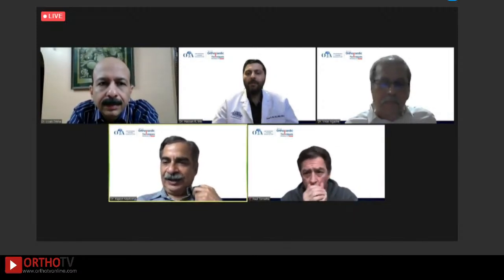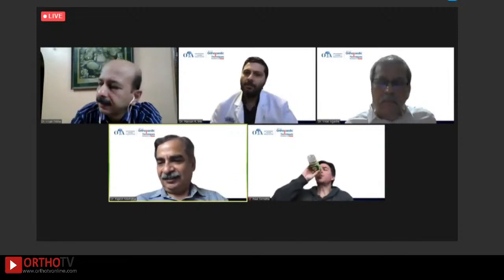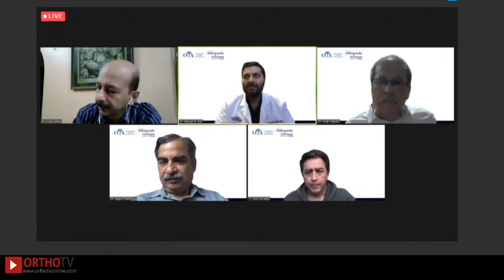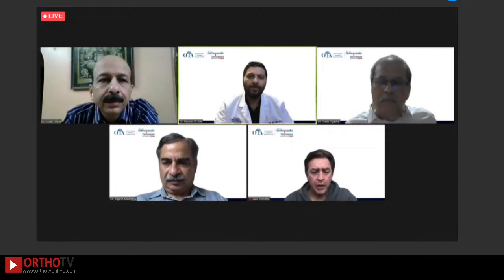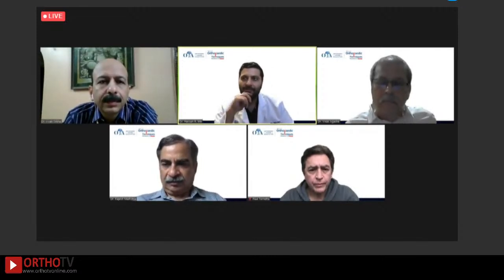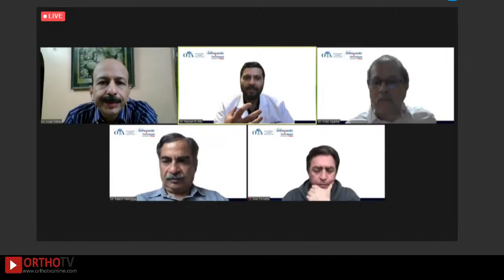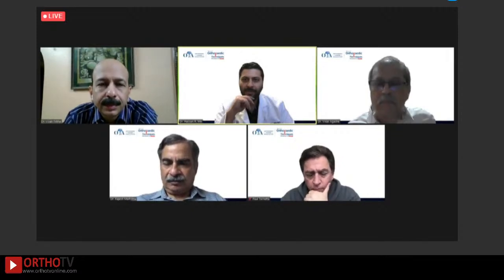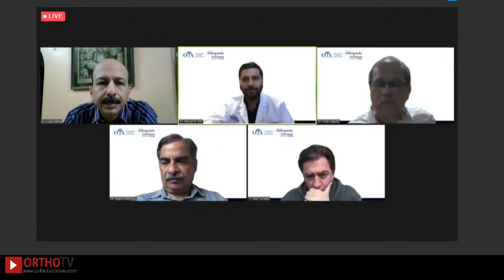Dr. Hassan, would you like to supplement that answer? Right. So I think that augmentation is an interesting concept, but to me, I don't know that PMMA is the right way to go. I think there are other substances coming out that may be better and that'll work with implants that might be more advantageous. Because from my understanding, and correct me if I'm wrong, the PMMA that you're using is also exothermic, and so you're frying the inside of the head that you're trying to salvage and save. So that doesn't make sense to me. If you can use something that's not exothermic and that also is more biologic and will remodel, then that makes a lot more sense if you're going to do augmentation with another material.